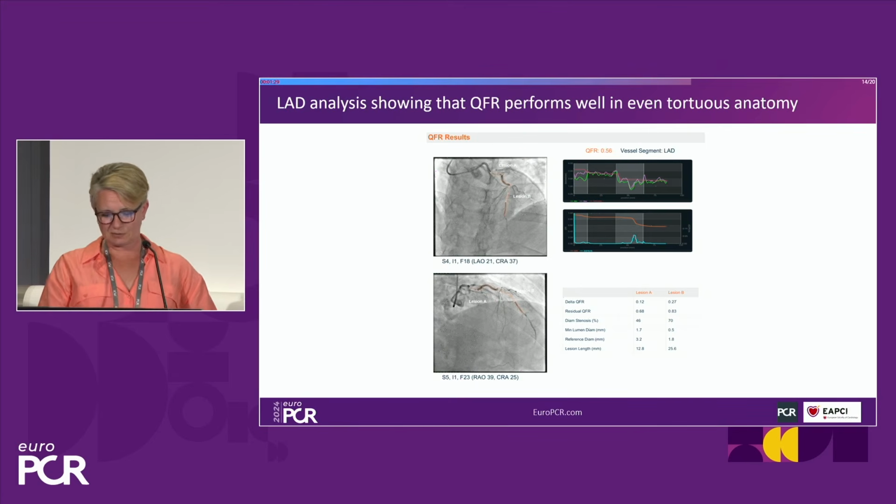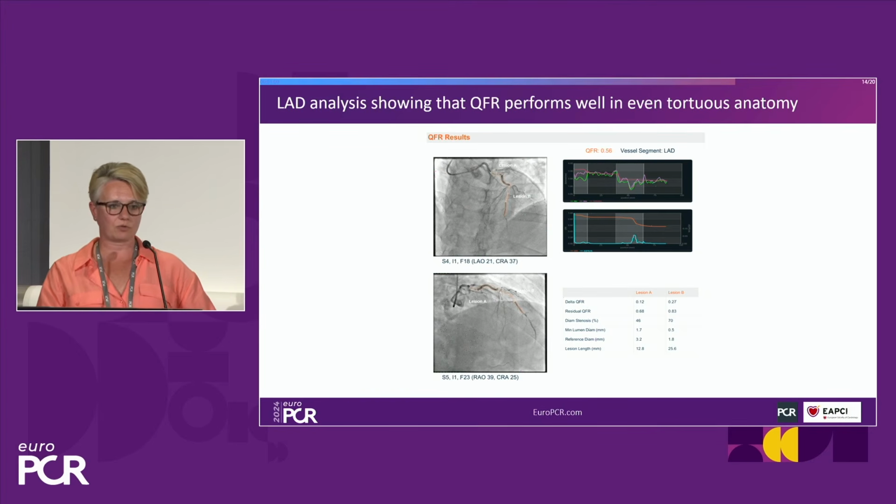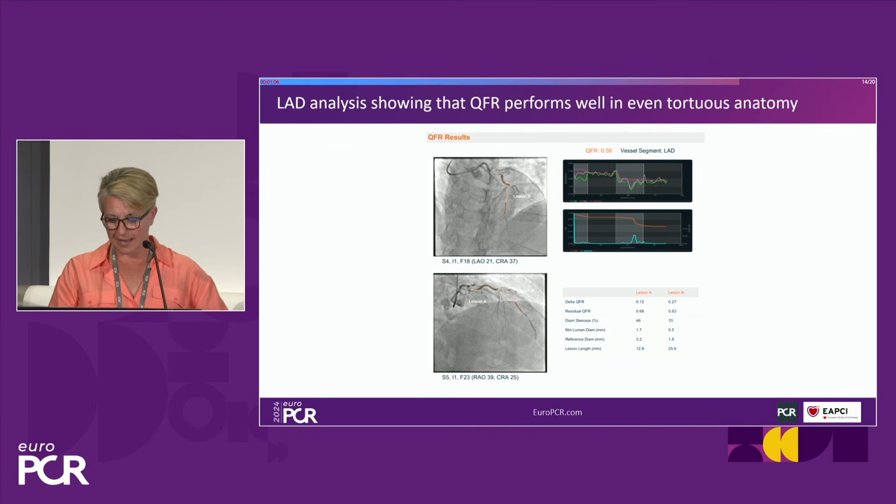And indeed, instead of going to the surgeon, we again did first LAD analysis. And you can see that this LAD vessel is very tortuous. So I think QFR here is positive, of course, but there are some cases where, when you have such a tortuous vessel, your FFR will be falsely positive and the QFR will show that the actual vessel is okay. So it performs well even in tortuous anatomy.